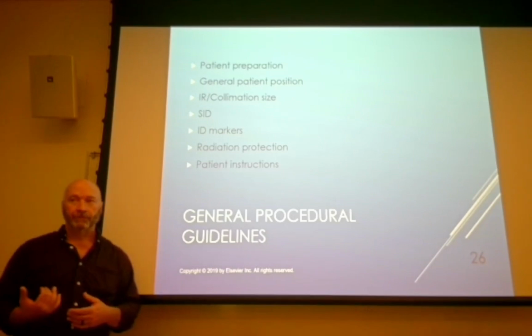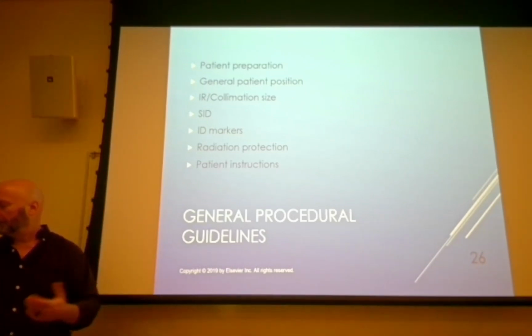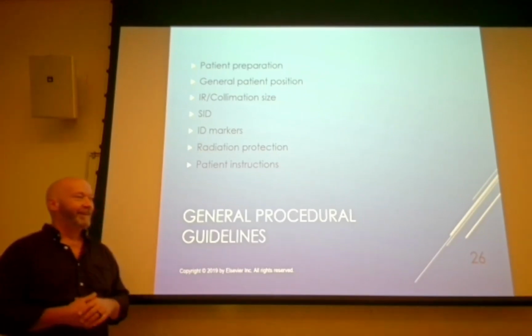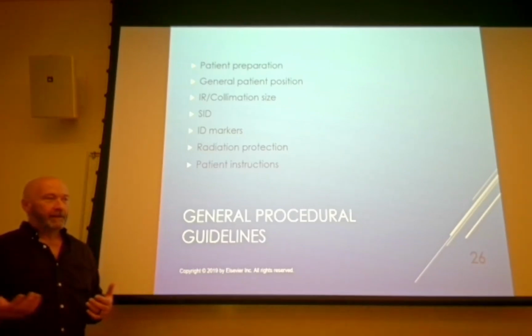You almost never do a 2-view for the C-spine. And I'll explain that here in a minute.